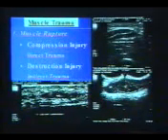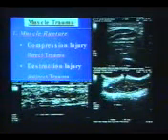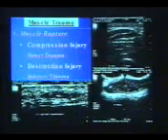At times there are also small contusions, which are very painful. Here we can see a small contusion injury on the anterior compartment of the leg, with a small hematoma, a lot of fluid collection and perifocal edema. This is the hematoma which we get on accident and small contusion of the muscles.